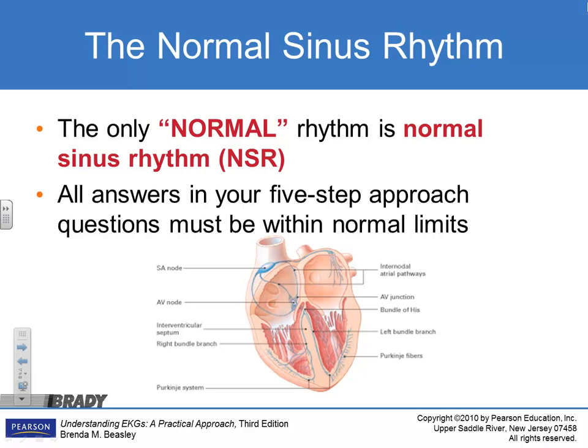There are two parts of P wave. That's why I put two. They must be present. They must be upright and uniform. Yeah. PRI? What's that? PR interval. What's it got to be? I wrote that in the wrong place, didn't I? Yeah, it's got to be 0.12 to 0.20. What does that mean? Yeah, so the PR interval is, what does it encompass? The P wave and up to the beginning of the QRS. That's going to be the PR interval. Okay, so we know the PR interval meets these parameters.